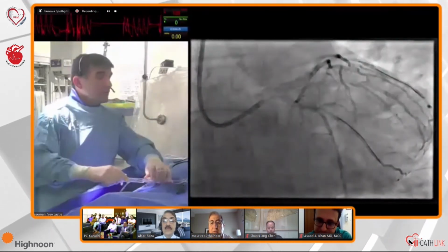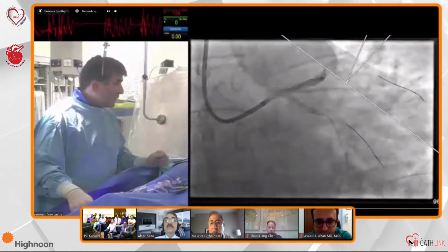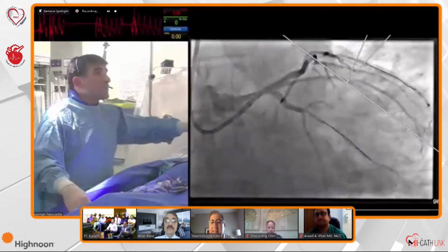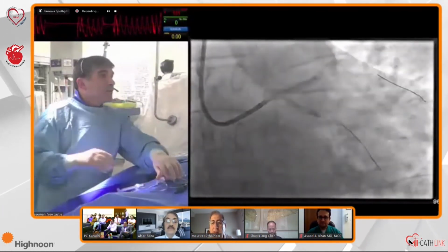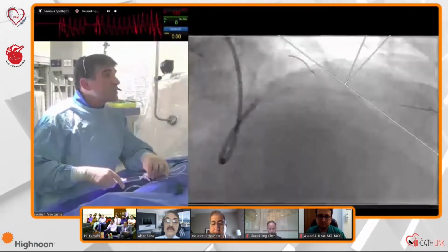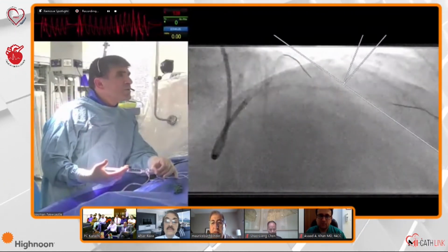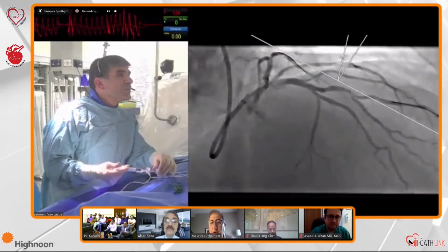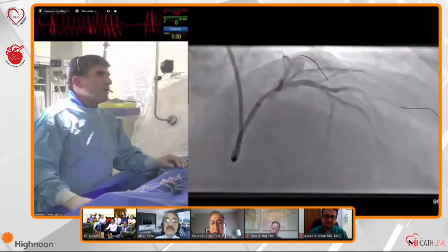Yeah. You can see it now. RAO cranial. Turn your head to the left. Looks fantastic. It's very good. Excellent. Well done. So I think what we'll do is just to see the sizing. I think an 18 probably, maybe longer. Let's see. Yeah, I would say more like 20, 22. Yeah, 20, 22. You're right.